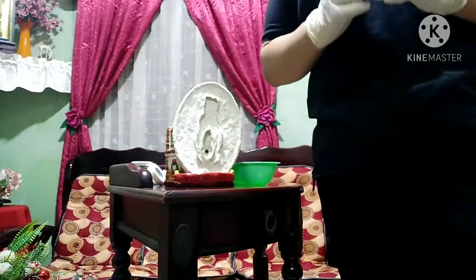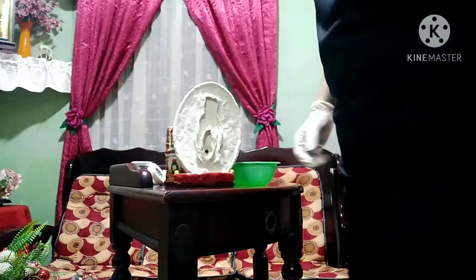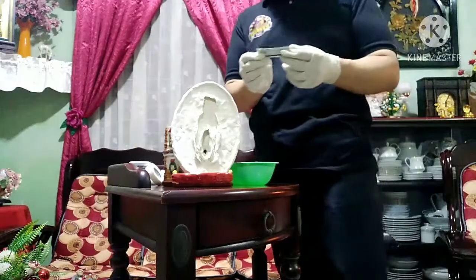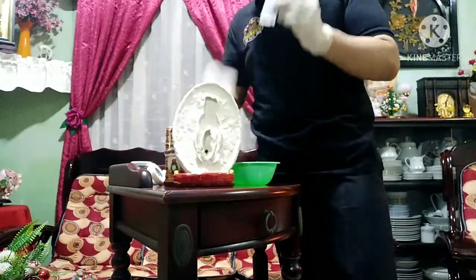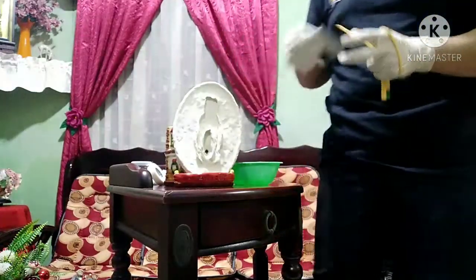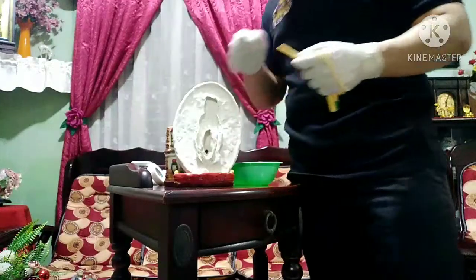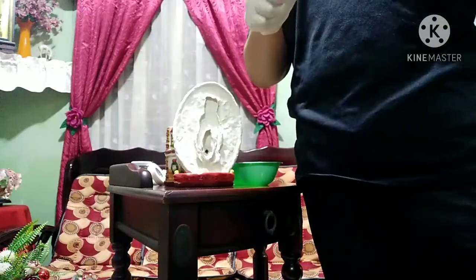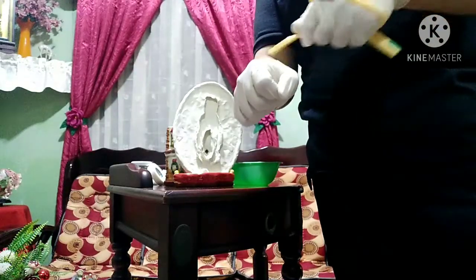Step 16, pick up the catheter and lubricate about 1 to 2 inches from the tip. We will take the lubricant. This is the catheter. We will apply it here, lubricating the tip of the catheter, just like this.